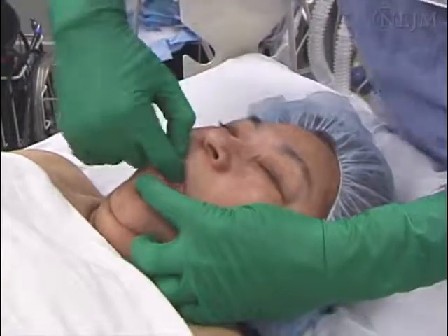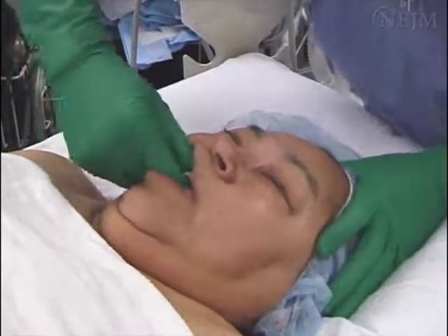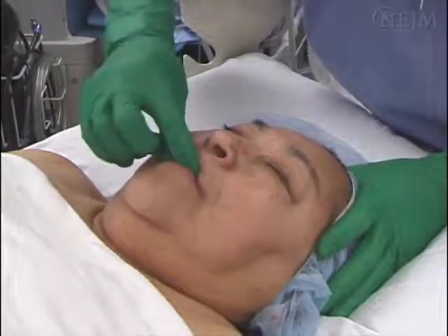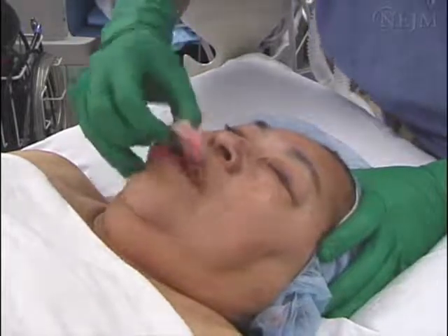Before beginning face mask ventilation, it is prudent to examine the patient's oral cavity when possible. Smaller dental prostheses or other foreign bodies can be swallowed or aspirated. One may consider leaving full dentures in place to provide a better mask seal.